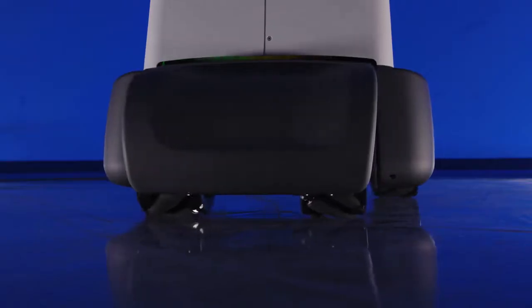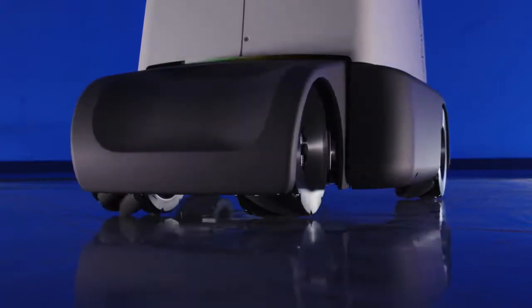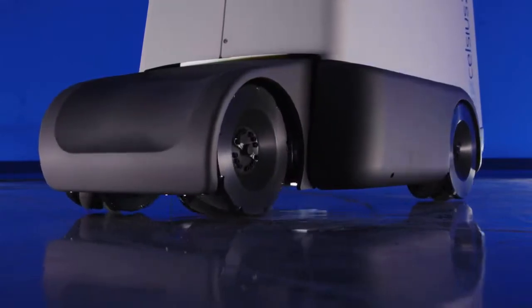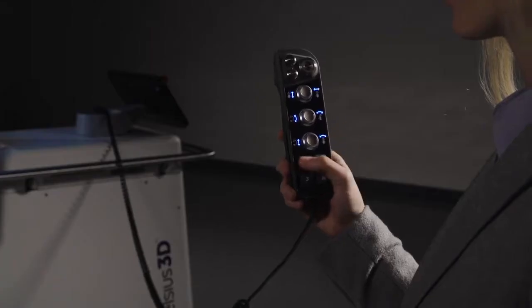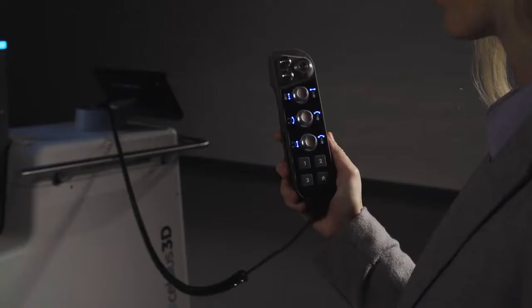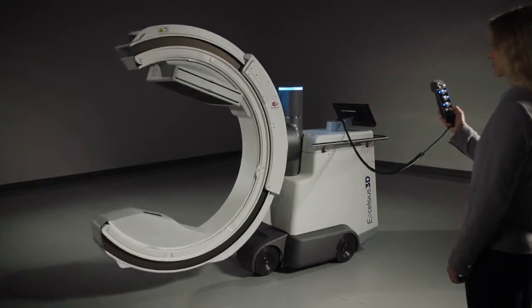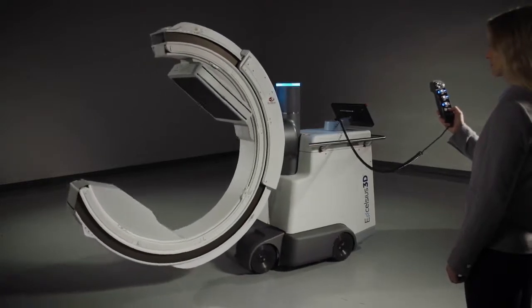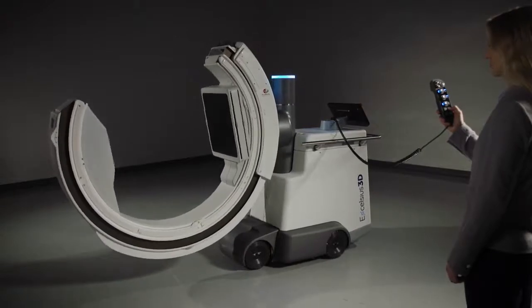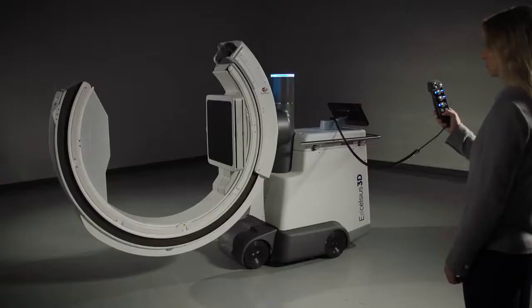The omniwheels also offer intelligent maneuverability through position memory, which permits the user to store the system's position and return to that position throughout the case with a simple press of a button. Excelsius 3D stores the position of the base, gantry, and collimation for fast imaging setup and acquisition. Simultaneous motion in multiple axes expedites movement to these frequently required positions.